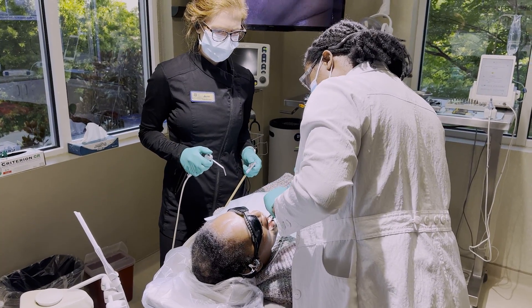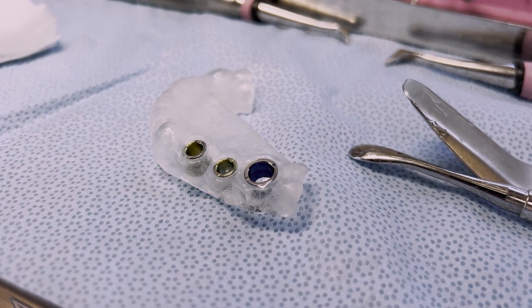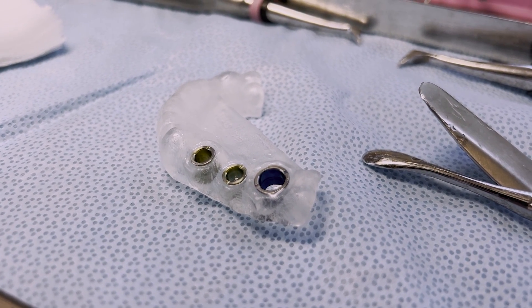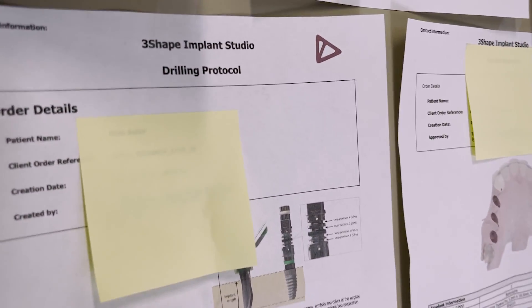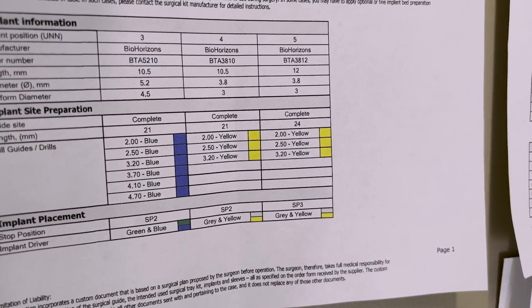All right, we're getting started, getting local placed. Here's our star of the day — our surgical guide. It's a type 4 fully guided, implying that the implant is placed through the guide, and it's dentition-supported, so type 4D. And here's our drilling protocol. I'd like to tape it right to the back wall so we can see exactly what we're going to be doing today.